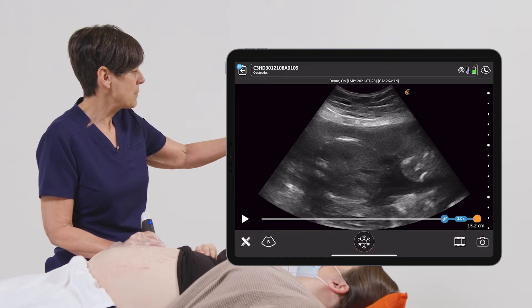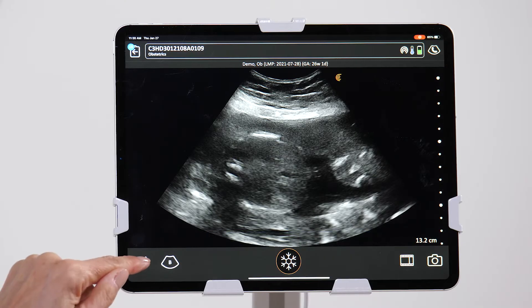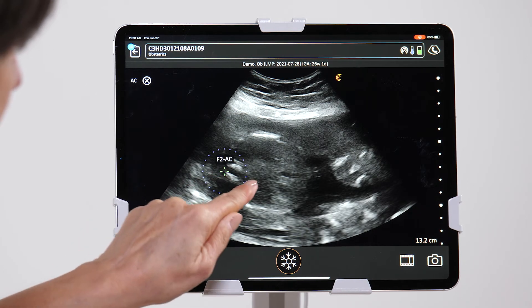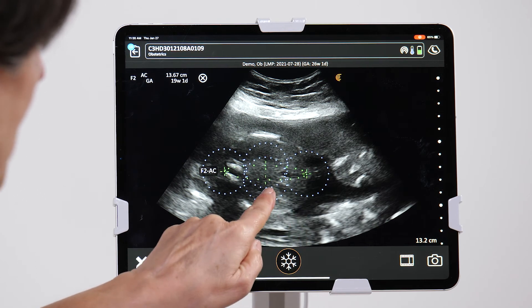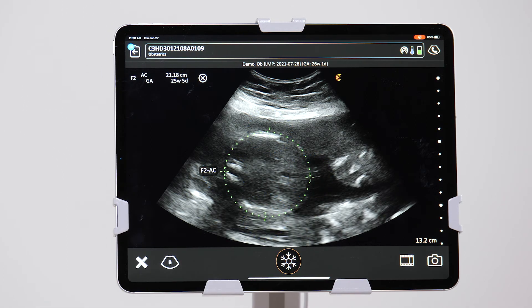I'm going to back up just a few frames here to get a nice crisp image, and then we'll go into the measurement package. From here I can add an abdominal circumference, place my caliper at the spine, the other one at the front of the baby's abdomen, and we can make fine-tuning adjustments until we get a nice abdominal circumference measurement.